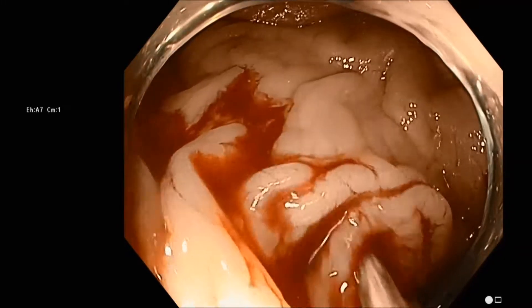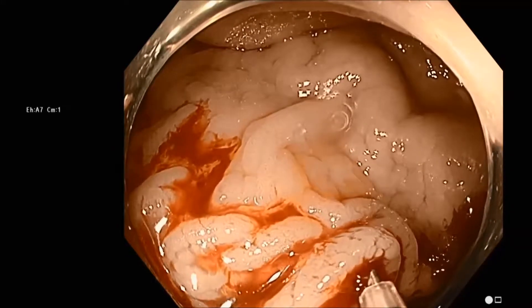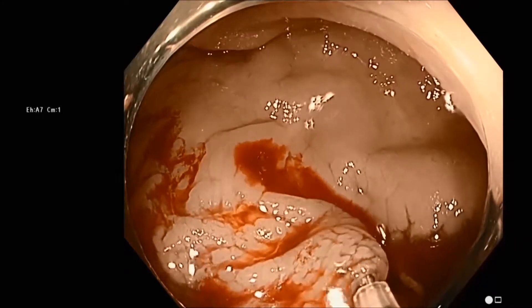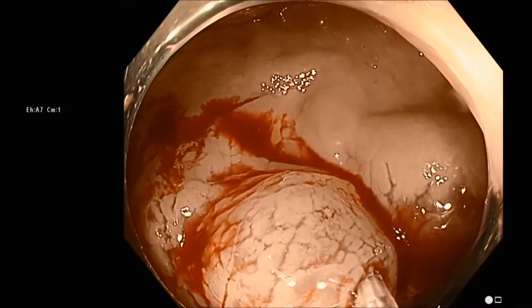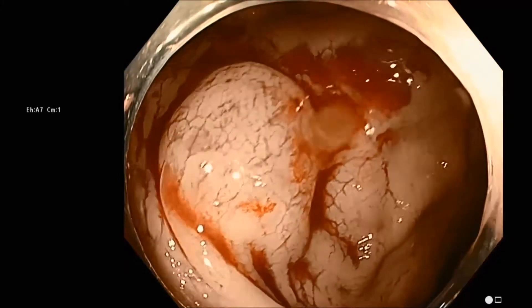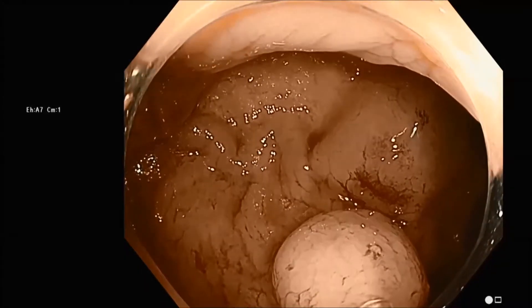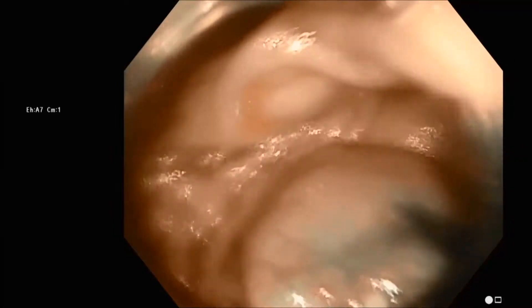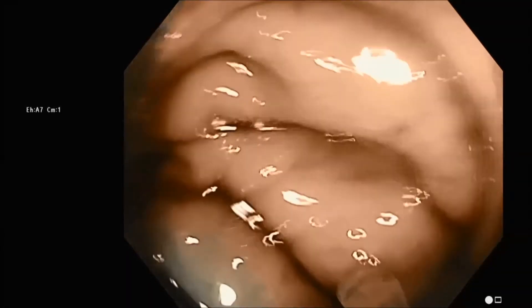In this en face position, just poke a little bit and then pull back on the needle to see if the needle is in the submucosal space. You can often see the actual shape of the needle. There are our nice submucosal saline blebs. Now we've flushed the catheter with Spot and we're going back in and putting 1 cc of Spot into each of these initial saline blebs, and that's going to finish the job for us.